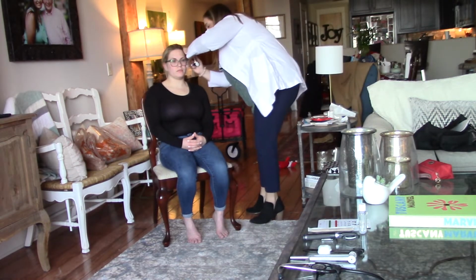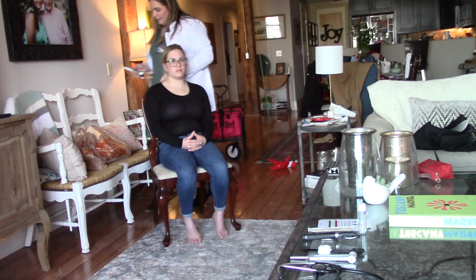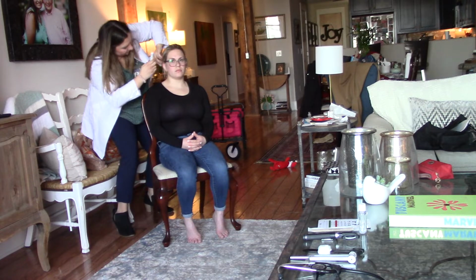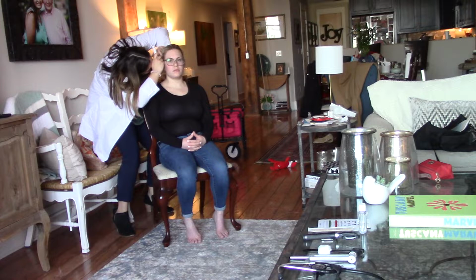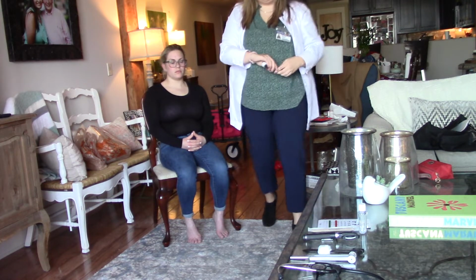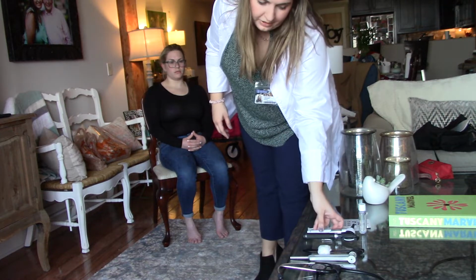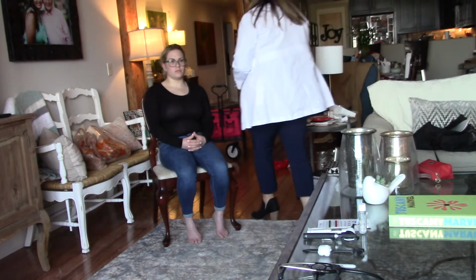So I'm going to pull up here, and I can see the cone of light, and the tympanic membrane is pearly gray. I'm going to assess on this side as well. And same on this side. I'm going to go ahead and assess cranial nerve 8, which is your vestibulocochlear nerve for your sense of hearing.